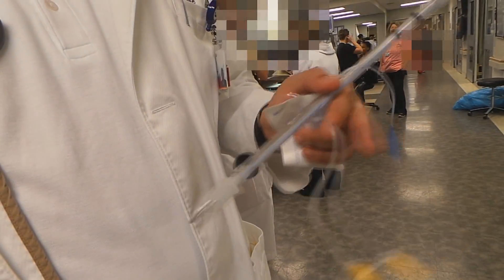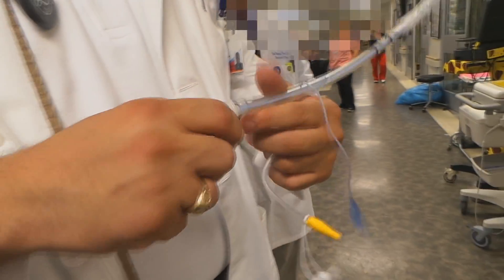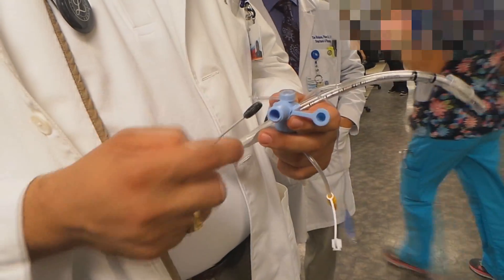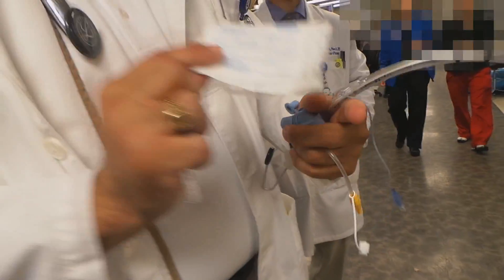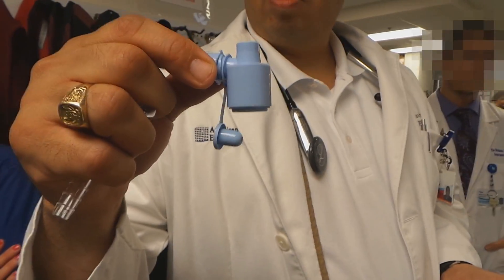So this is a suction-as-you-go ET tube setup, courtesy of MCRID and Scott Weingart's podcast. What you need is a fiber optic bronchoscope swivel adapter, which is this, that you can get from endoscopy or from bronchoscopy.